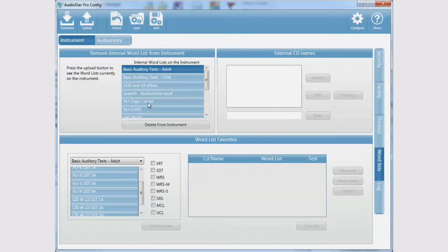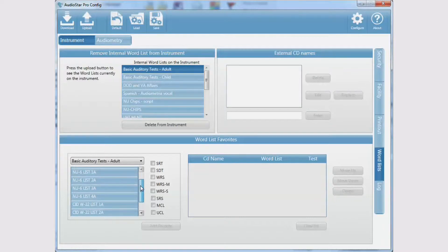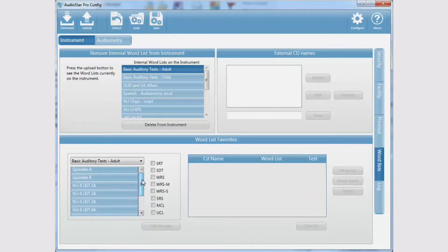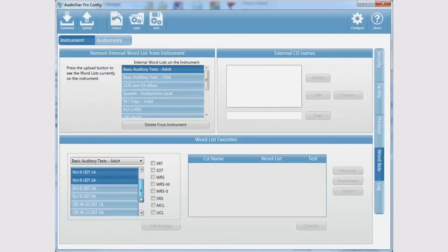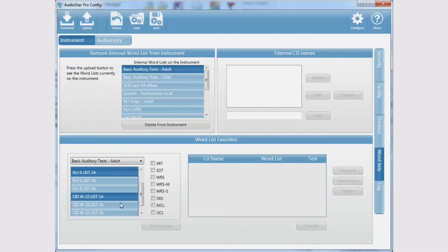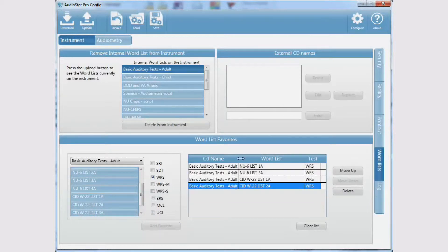To create a favorites list for word recognition tests as an example, select from the drop-down list of CD names to locate the lists used most often. Be sure to check the WRS test type. Highlight the word lists used most frequently for word recognition testing and click on the Add Favorite button.